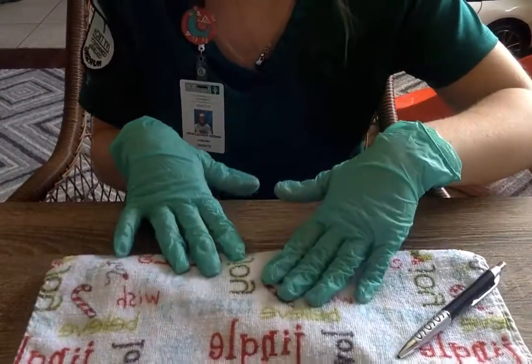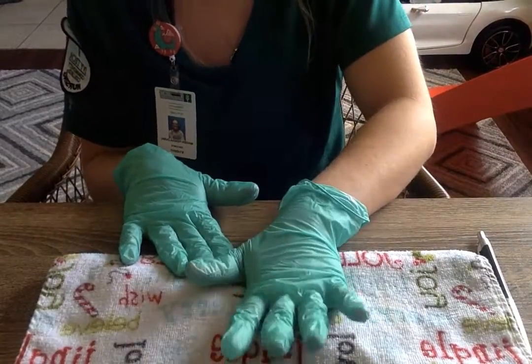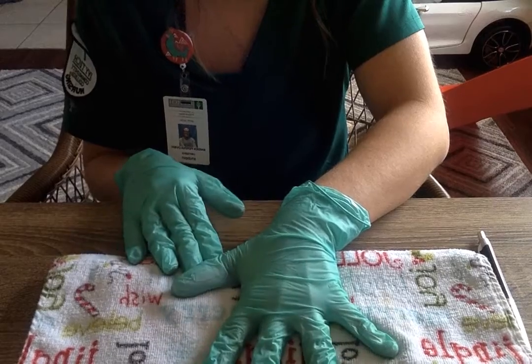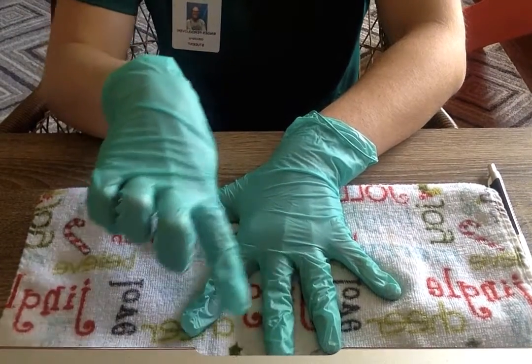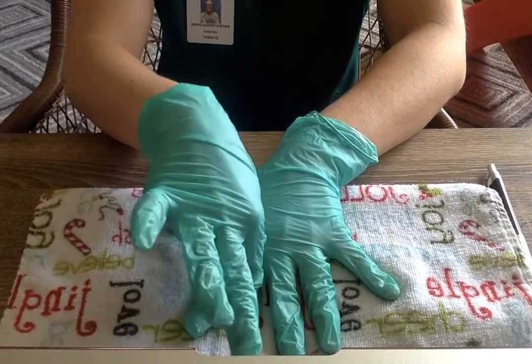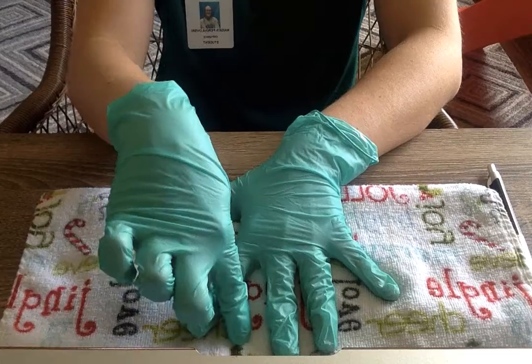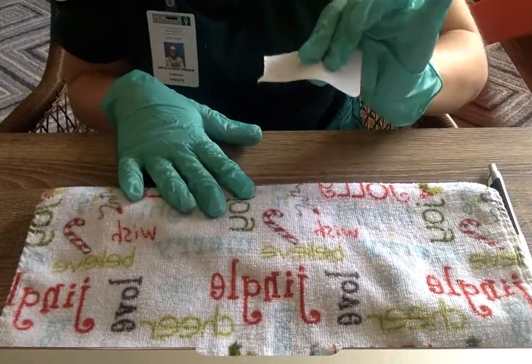And to find the actual spot, I would put my palm down like so. I would spread my fingers, and in between my pointer and my middle finger would be my injection site. So I would make a marker and realize that that's where my site is going to be. Then I would take my alcohol swab.